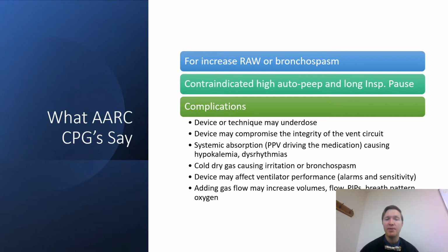You're like, hey, they have a lot of auto-PEEP because they're air trapping. Well, let's try to fix that. And maybe if it's a bronchospasm thing, maybe we need to figure out what's causing it and work the cause.